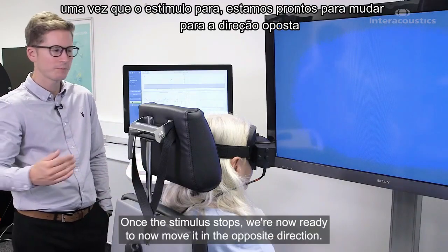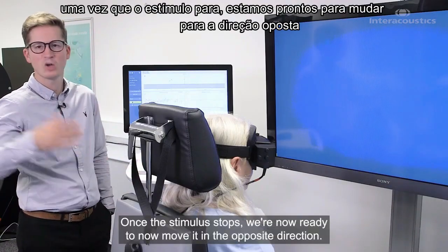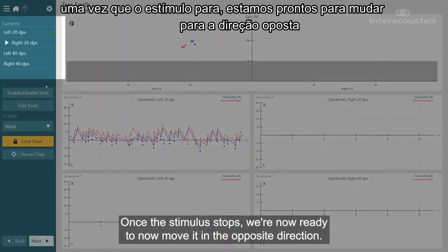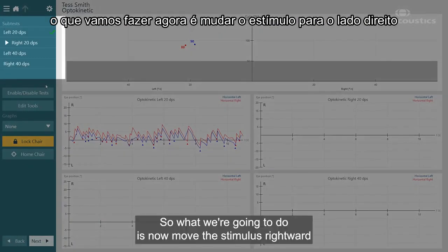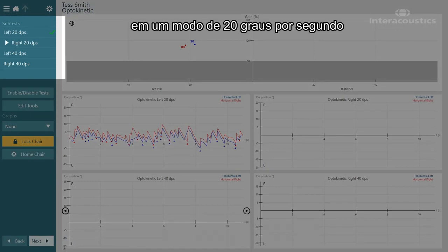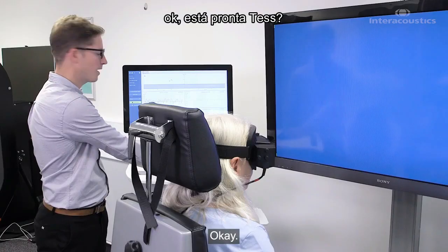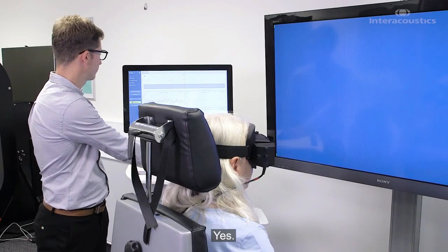Once the stimulus stops, we're now ready to move it in the opposite direction. We're going to move the stimulus rightwards at 20 degrees per second.